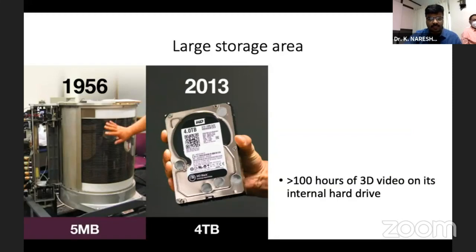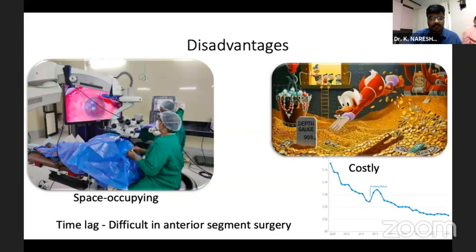It has a large storage area. More than 100 hours of 3D video are available on its internal hard drive. There are a few disadvantages at present. It is a space occupying device. It is costly, but as we know, the cost will definitely come down. And there's a time lag, so there's a bit of difficulty in anterior segment surgery.